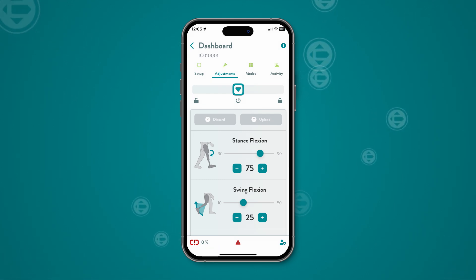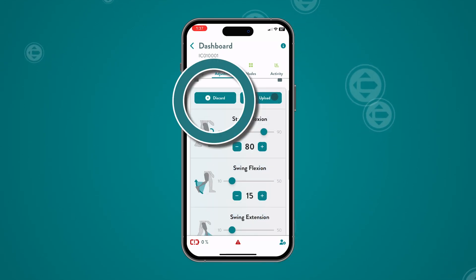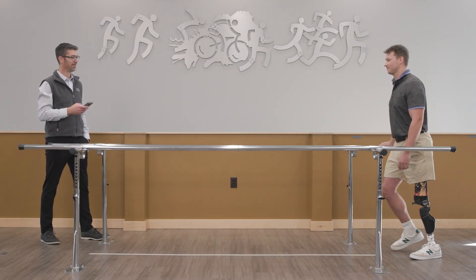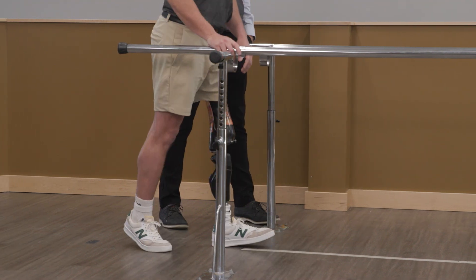Users will not feel any changes until they are uploaded to the knee. If you want to start over, tap Discard to go back to the previously saved settings. Begin by adjusting the stance flexion resistance. Use the sliders to increase or decrease the setting.